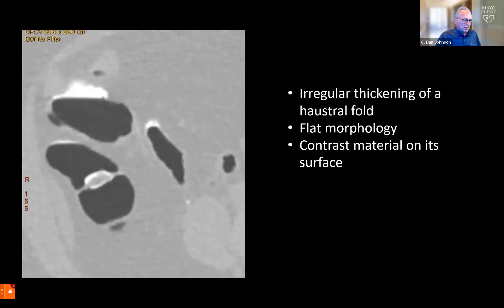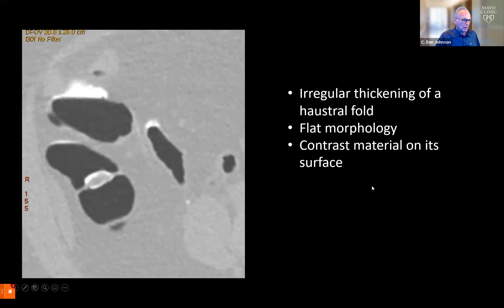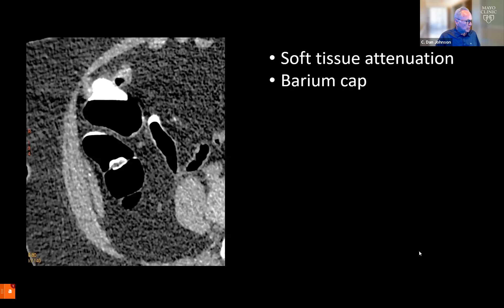On review of the images from the colonography exam, a thickened haustral fold that was somewhat irregular on its surface was identified with some surrounding contrast material — barium — from the barium administered the night before for stool tagging. Notice the lesion has flat morphology. Using soft tissue windows, the lesion can be identified with a robust barium cap on its surface.